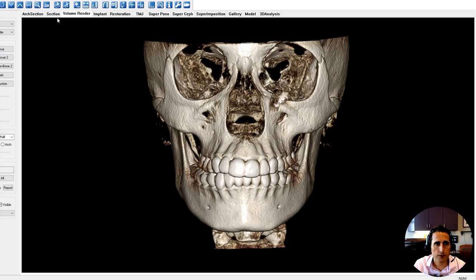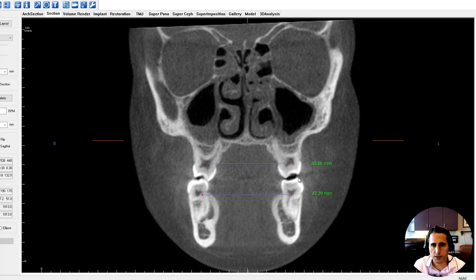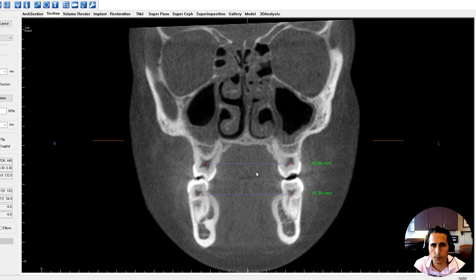She has a fairly sizable jaw size discrepancy. When we measure from the middle of the basal bone, the upper is about 43 millimeters and the lower is about 47. Ideally, we want to see the upper jaw about 5 millimeters wider than the lower jaw. At this patient's age, she has less than a millimeter of transverse growth left on the maxilla. The teeth have compensated — the upper is flaring outward and the lower, in lingual crossbite, has tipped buccally.